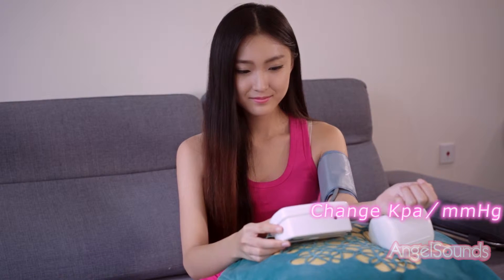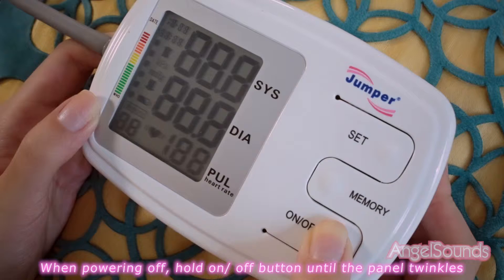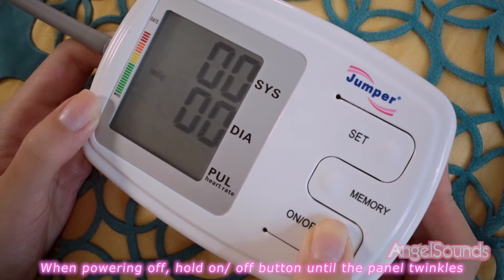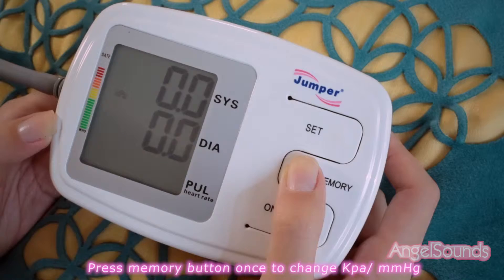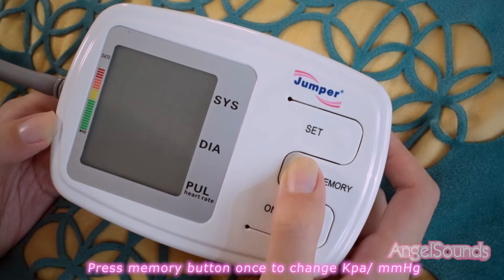Settings: to change KPA to MMHG, when the device is powered off, hold the on-off button until the panel twinkles. Then press the memory button once to change between KPA and MMHG.